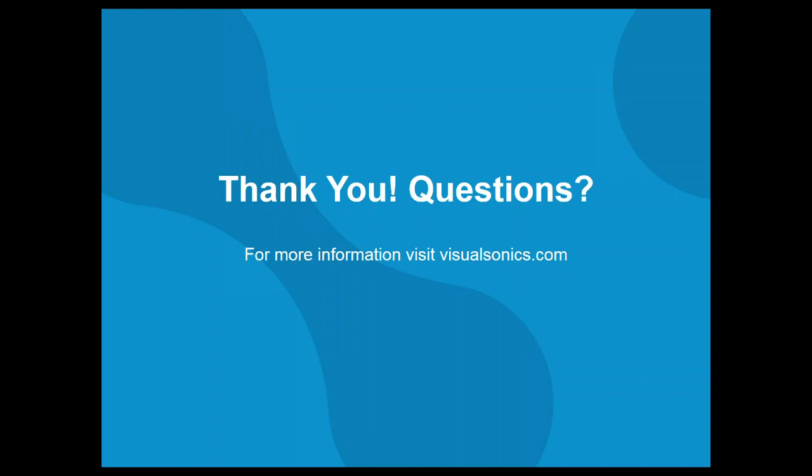Another one, actually from the same person, is asking about the MI, or the mechanical index, that's used on the Vevo system. This is kind of an interesting topic. We have numbers for the MI on our systems with all of our transducers, and we can share those with customers.